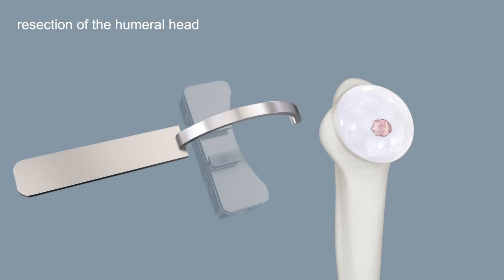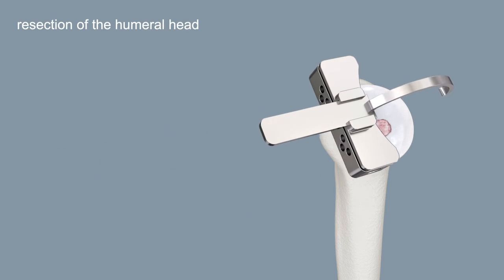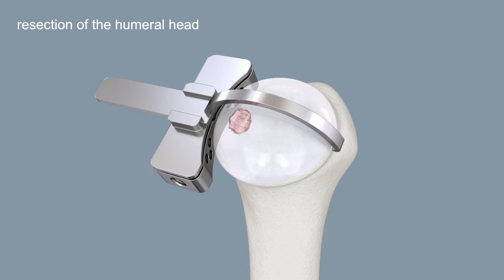Select the best-fitting adjustment arm. Slide it onto the cutting block and position the tip of the hook posteriorly on the anatomical neck. Align the slot of the cutting block with the anterior neck.